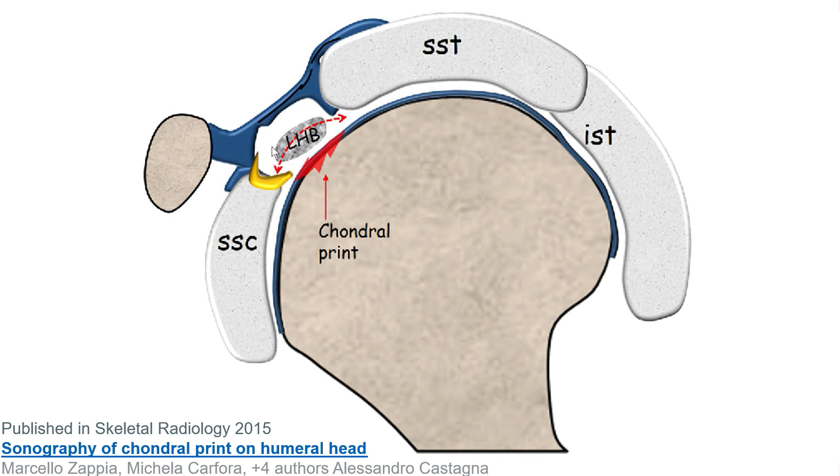It also nicely illustrates that the long head of the biceps tendon is typically positioned just in the middle between the anterior border of the supraspinatus tendon and the upper border of the subscapularis tendon. If it's displaced medially or a little bit downward, that can be a sign of a pulley lesion.